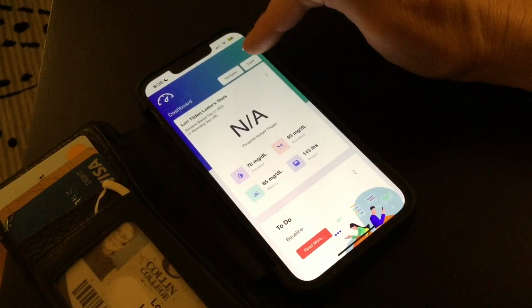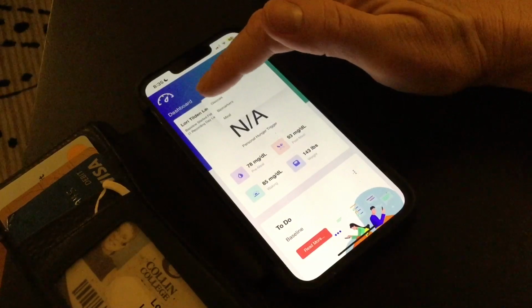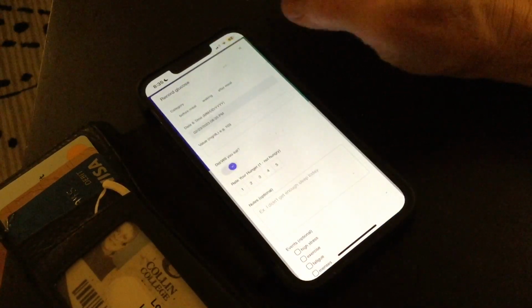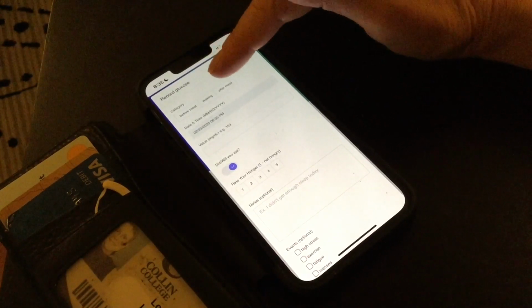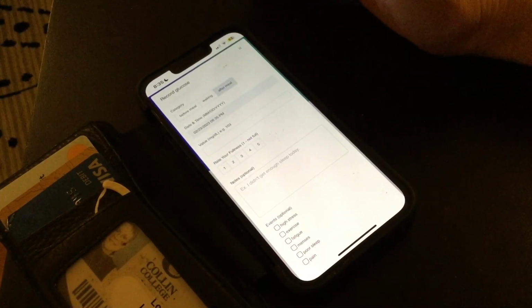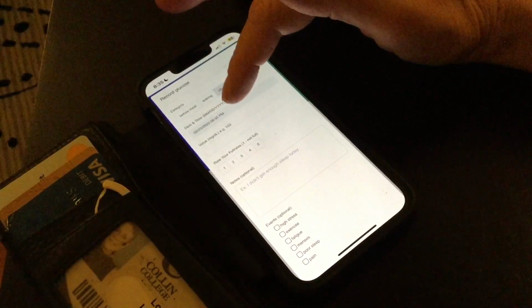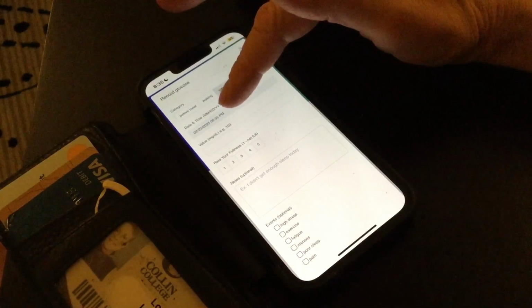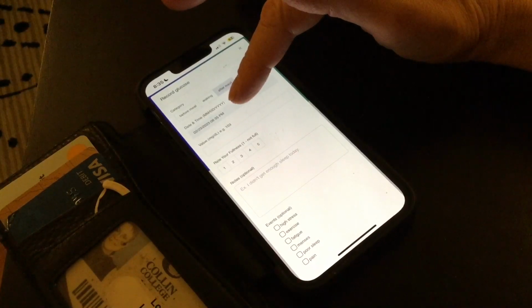So I'm going to hit the track button, touch that, and touch on glucose. And I want to use the after meal value, so I'll touch that. Now, this time shows what time it is this evening, 8:35 p.m. I want to have it show my post-meal glucose value.